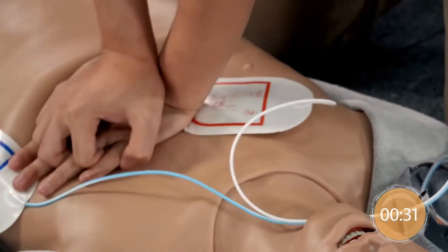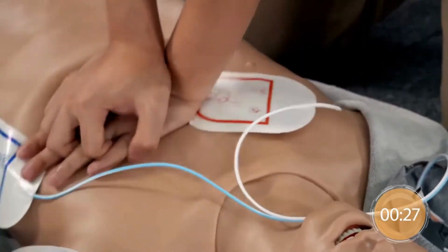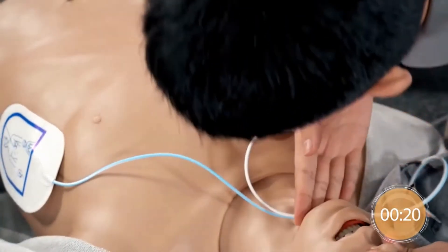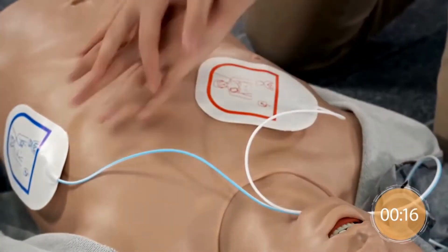Give chest compressions immediately. Give 2 rescue breaths. Continue with compressions.